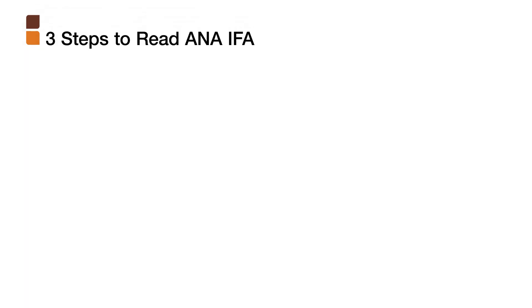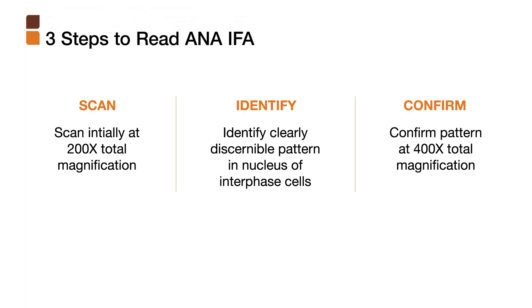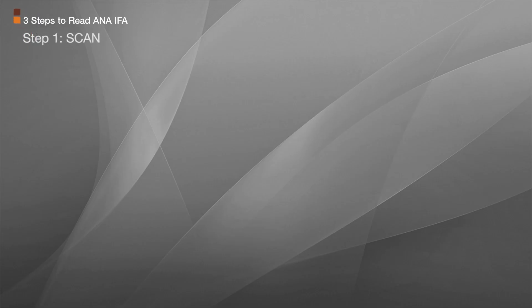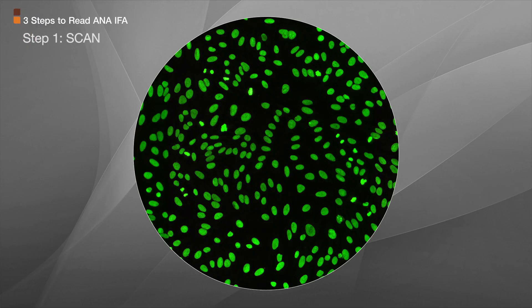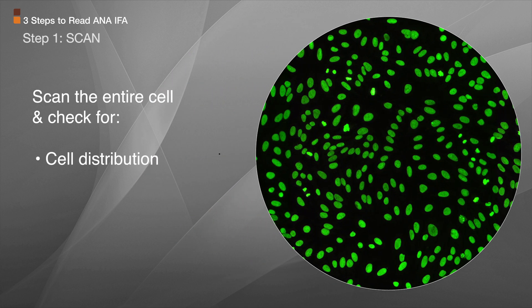So let's hold on to this information and simplify reading ANA-IFAs by breaking it down into three steps. Step 1: Scan the entire well and check for cell distribution, cell morphology, and the uniformity of fluorescence.